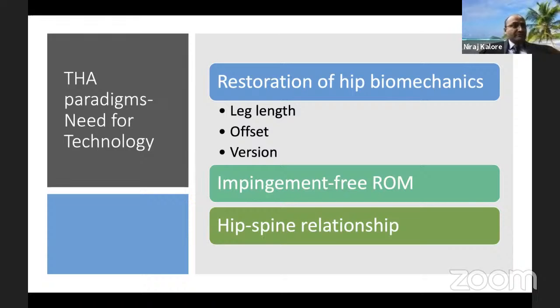That was the concept, let's say, 5-10 years back, and it's still valid, but it has become more complicated because of this new highlight of the hip-spine relationship, which basically says that a cup that is covering the femoral head ball very well in a supine or in a standing position may not do so when you are in a sitting position or in a squatting position.